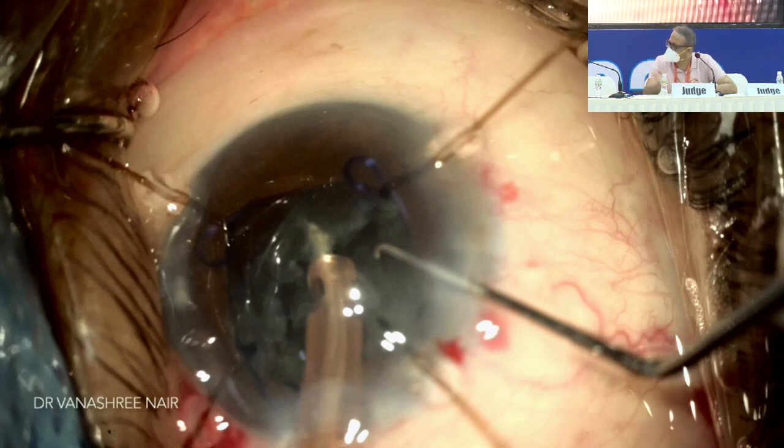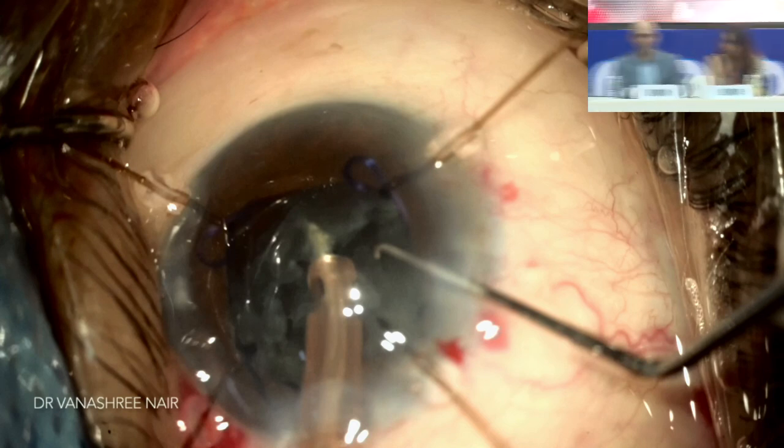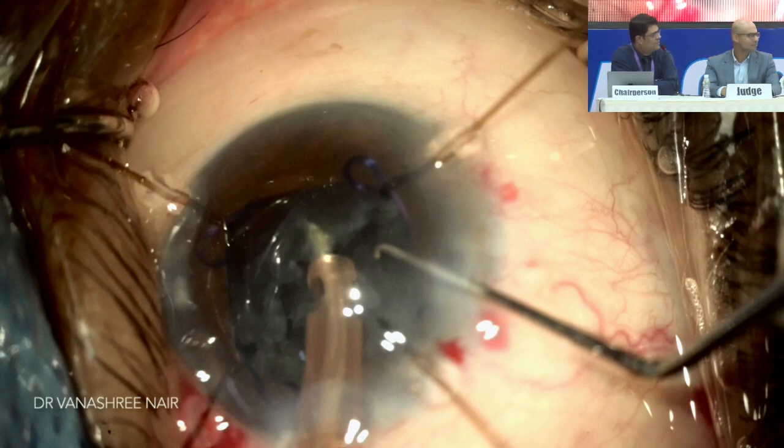I think you use injectors, if I'm not wrong, Dr. Harshul. No, more of a freehand only. I also use freehand. Madhu instruments give an injector with that. That's good. If you have Morcher, that's wonderful. That system is very good, but very expensive. So freehand works well. And any tips for inserting the CTR, Sheetal?